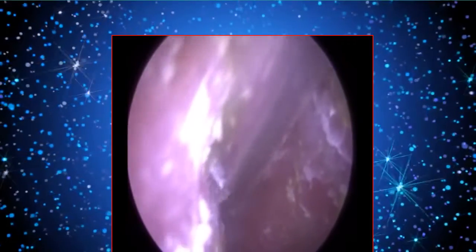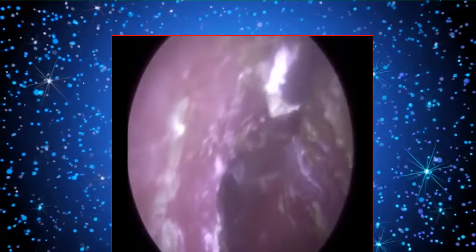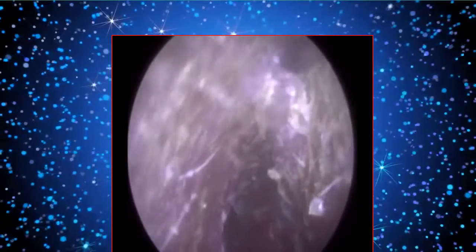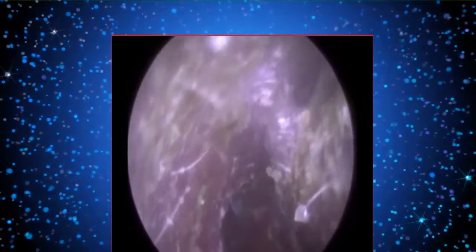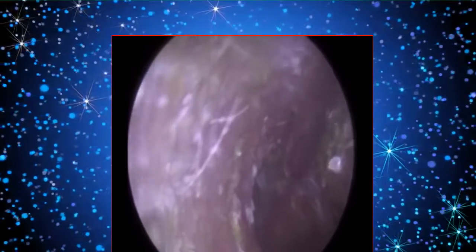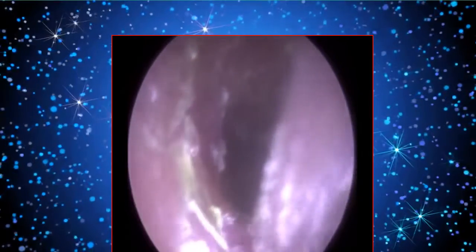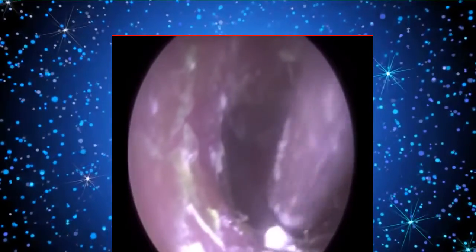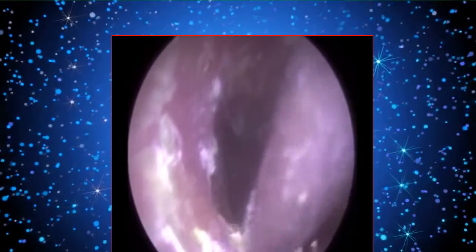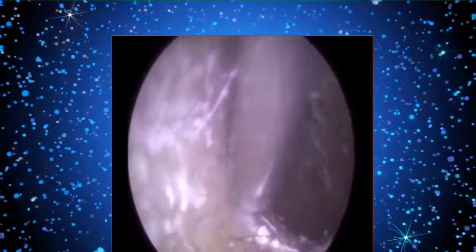So I'm just mopping up a bit of dead skin around the edge. Again, we've got to be careful in that region because it's the bony part of the ear canal, and it's almost like snake scales at the roof. So all this was discharge initially, and this discharge had coated the ear canal, and then the patient has been using the medication and it causes this discharge to crystallize. Sometimes it comes out in a cast of the ear. You suction and it comes out in one big cast.